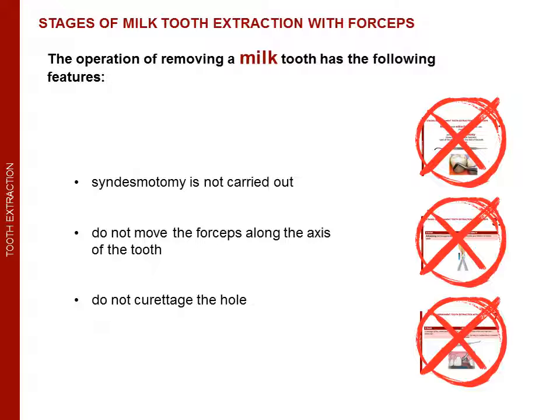Next rule, don't move the forceps along the axis of the tooth. Don't penetrate the forceps along the axis. And the next rule, don't curettage the socket, because you may damage the permanent tooth.